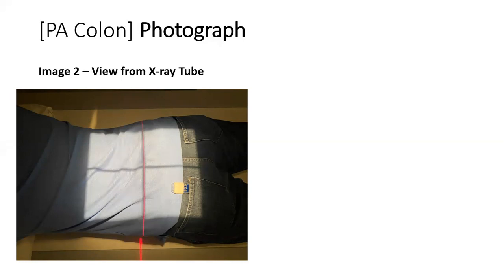The kVp range for our real patients would be approximately 110 to 125 kVp. The instructions to the patient for the exposure would be to inform our patient to stay still. We would be exposing on the expiration. So we would ask our patient to take a big breath in, blow all the air out, and stop breathing.